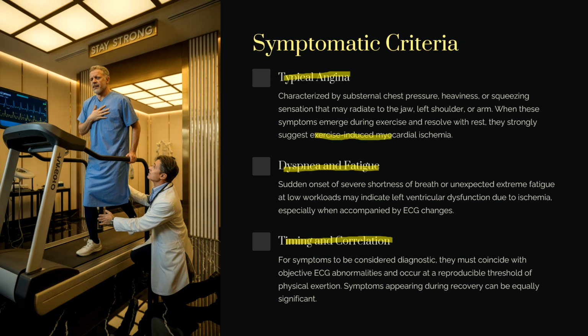That is exercise induced myocardial ischemia. That means when a person is given a certain exercise to do which is heavy for the heart, then there is an absence or deficiency of oxygen.